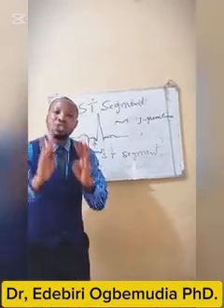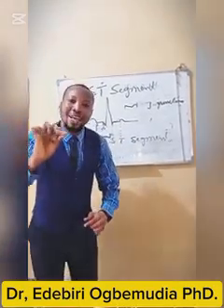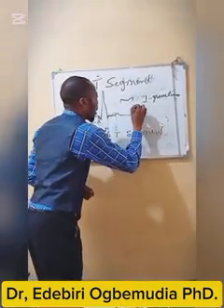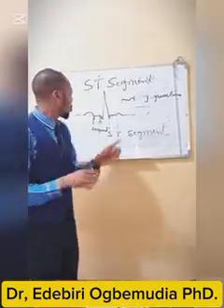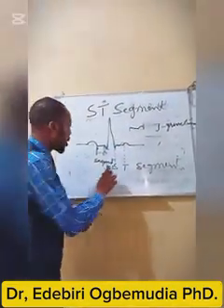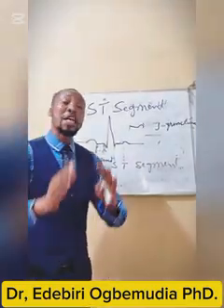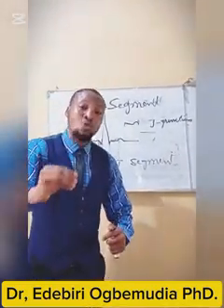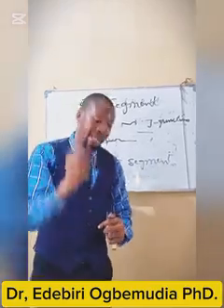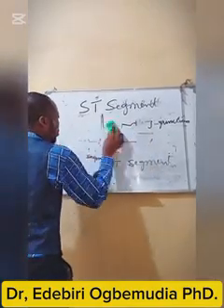In the normal ECG morphology, the ST segment is isoelectric. When I say isoelectric, it is a straight line. A straight line, you can see from here to here is the ST segment. But in a pathological condition, in some cases, the ST segment is elevated or depressed, and that is not a normal ST segment. So we'll now look into that. I will remove this.